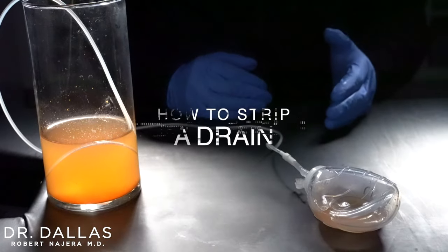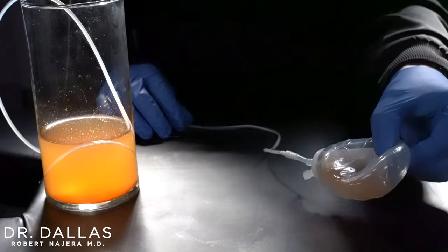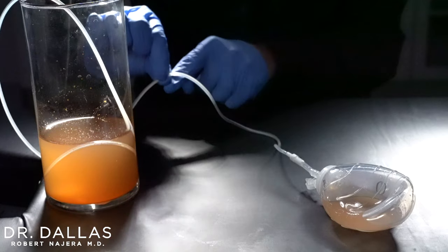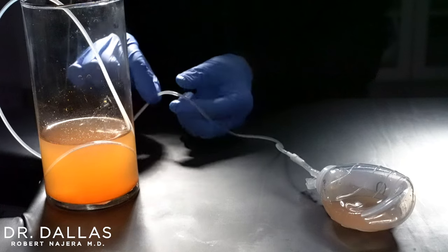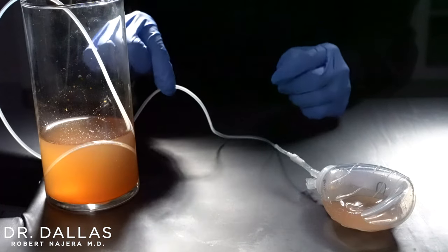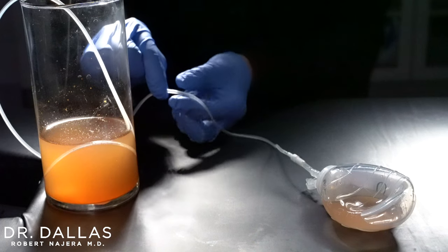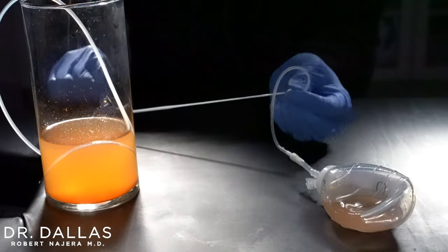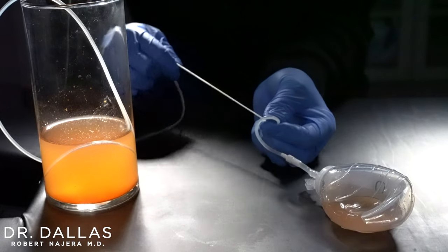I'm going to show you how to strip a JP drain, which is what we typically use in tummy tucks. Here's the bulb portion, here's the tubing, and this is the part that comes out near the skin. If you see a clot or it's not flowing, you want to strip the drain. The motion is: take one hand near the skin to stabilize that portion of the drain, then take the other hand.